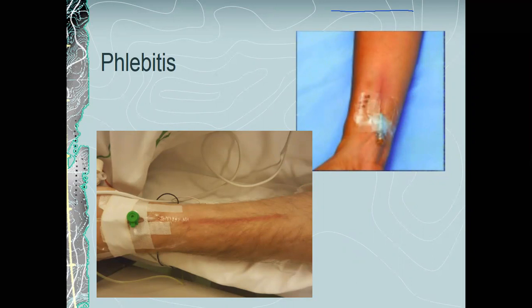If you can't, then just like with the infiltration, you need to start proximal to your patient. So you need to make sure you're documenting accordingly, following all your facility's policy on documentation and notification. So you may be tracking adverse events, and you should notify your physician in case they want to culture the site, because remember, inflammation can be sparked by infection. So they may want to culture that site.